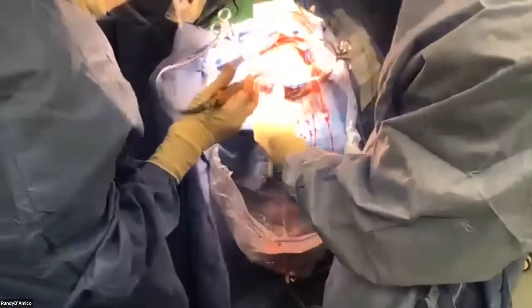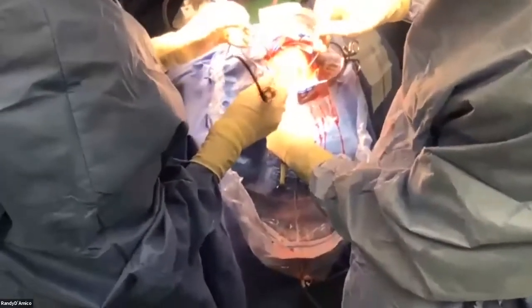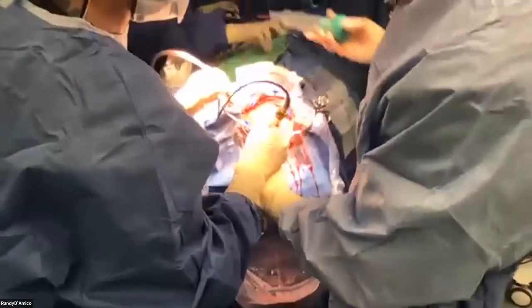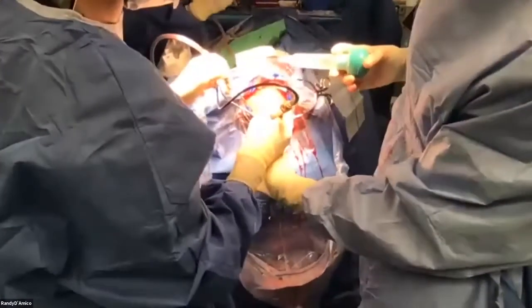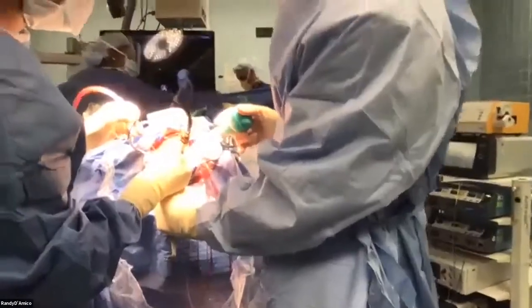You see irrigation to me also. So this back mark is actually right here. So if you're going to be, yeah, exactly, just like that, right? Just be careful with the sinus. Put it back down. It's okay that they can't see this burr. That's my hand. That's fine. I'm not going anywhere. So we're still drilling.